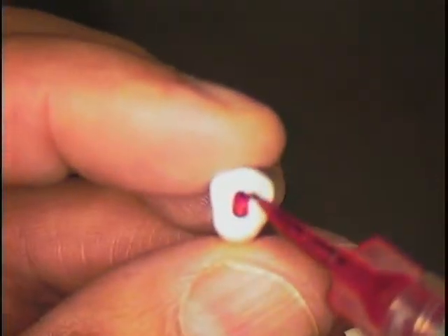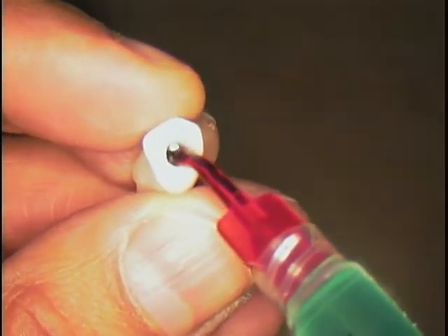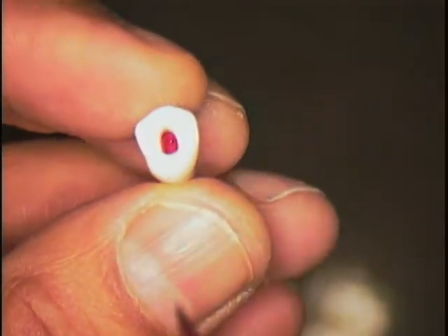Okay, so you can see there was some debris in there. How do we make sure we don't get that debris caught in any of the canals? Well, this is a lubricant. You put 1 drop of the lubricant in there. That's more than a drop. So you just suck it back in there. That's no problem. All right.